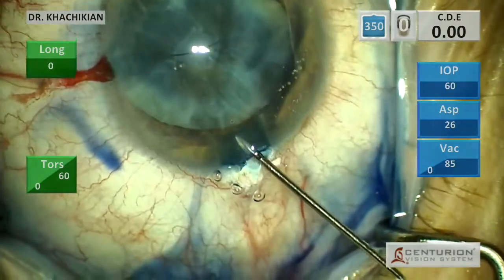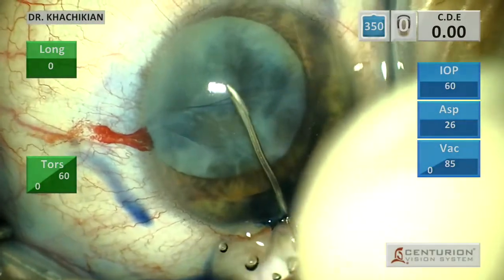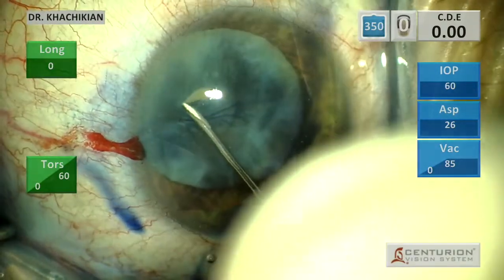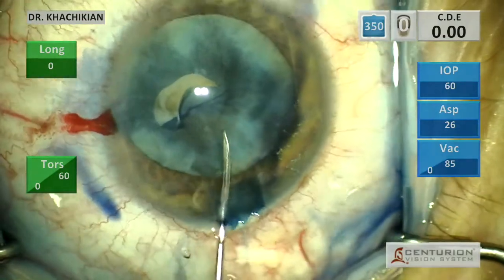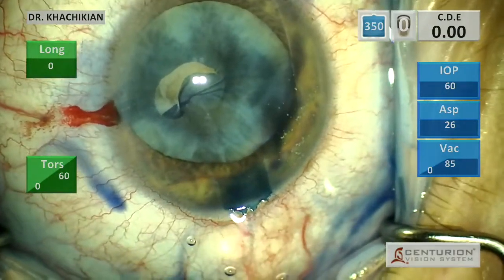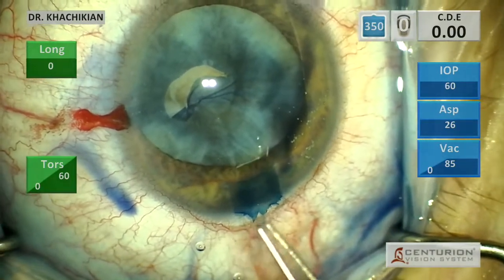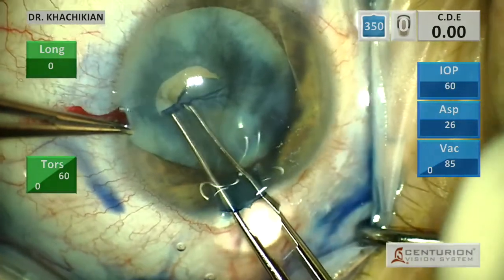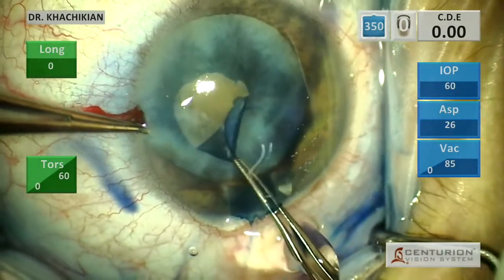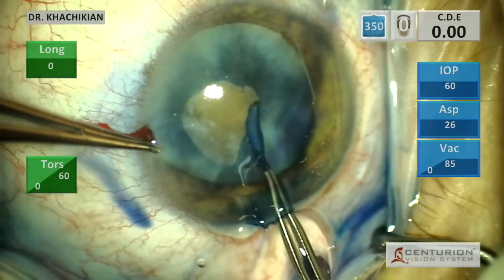Normally I'll begin the capsular rhexis with the Utrata, but given that band of contraction you can see right in the center of the capsule, I elected to use a Cystatome because it was difficult to tell how much trouble I would have piercing the anterior capsule with just the Utrata. So we initiate with Cystatome, and then continue the capsular rhexis with the Utrata.